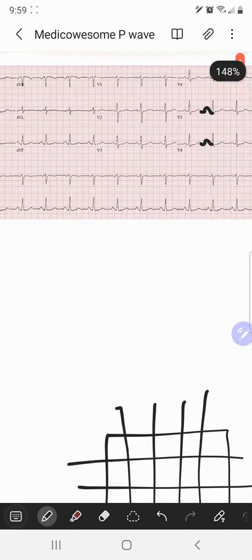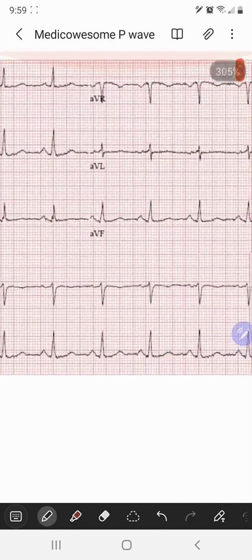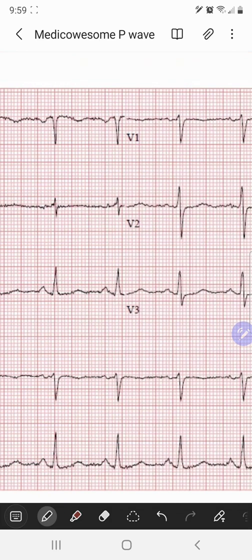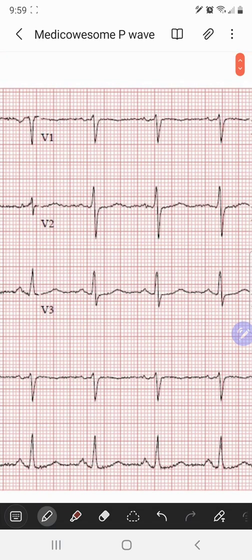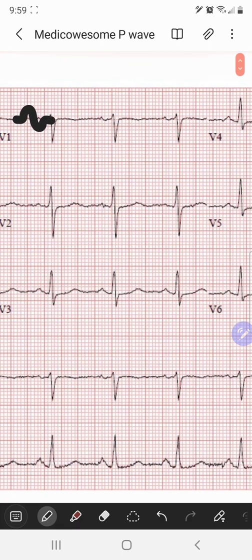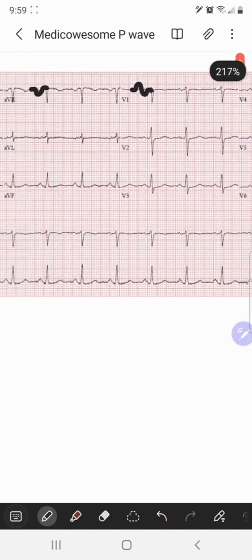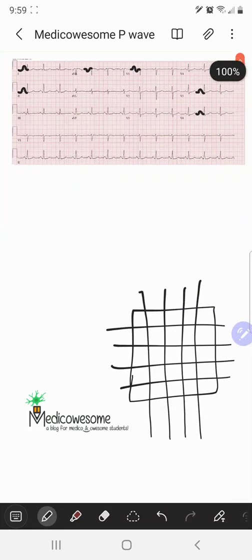The P wave would be inverted in lead AVR, and in V1 the P wave has a biphasic morphology — you can kind of see it on the EKG strip here. That covers the axis of the normal P wave, which is usually between 0 to positive 75 degrees.